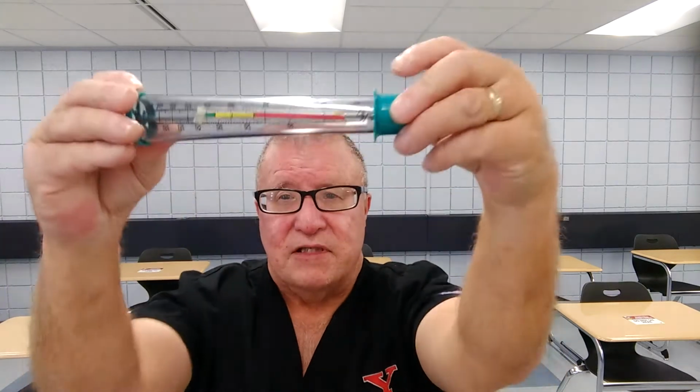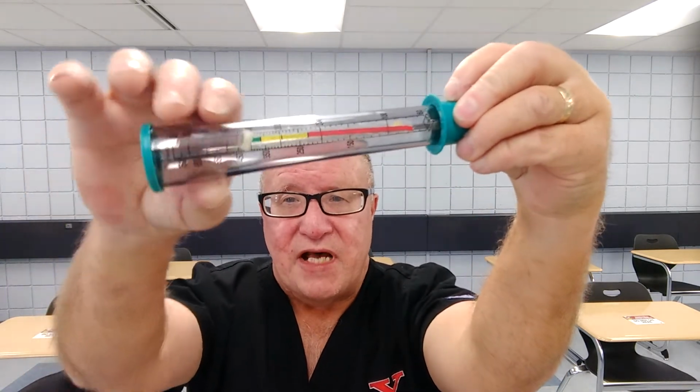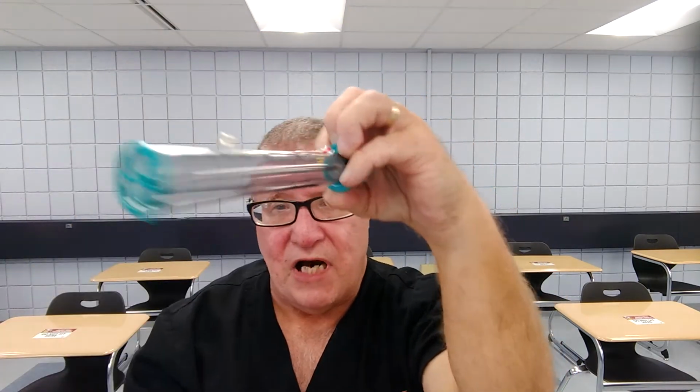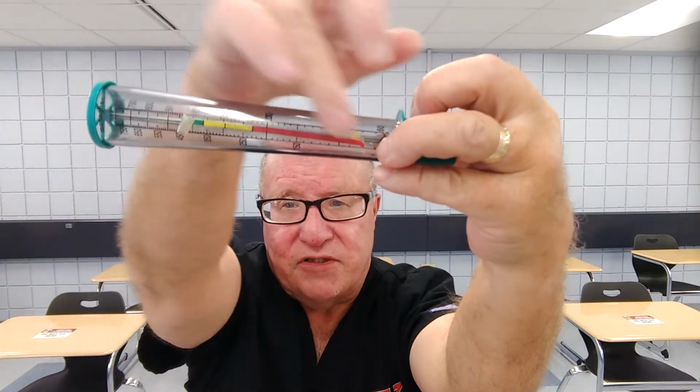Another one that you may see out on the market is similar to this, same basic thing. You blow through this end here, and you have a little yellow disc that moves up. Again, you read the number that's on the side, and that tells you your peak flow.